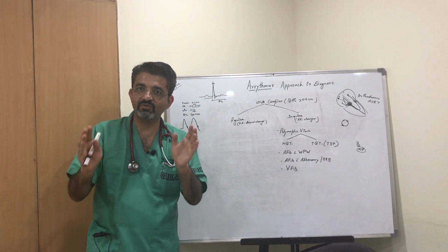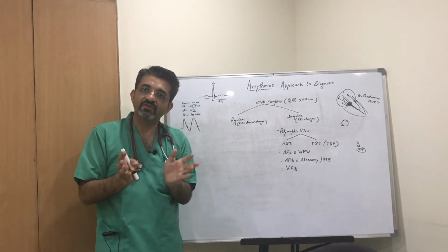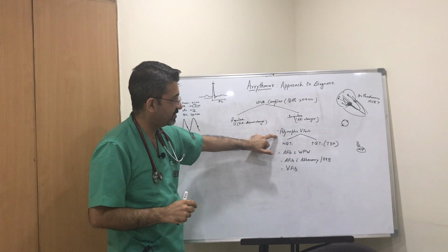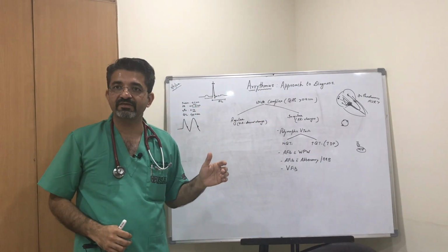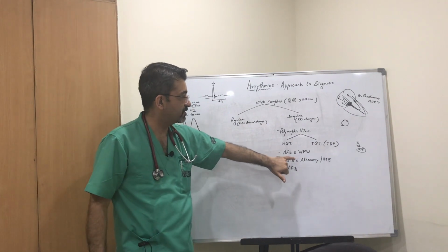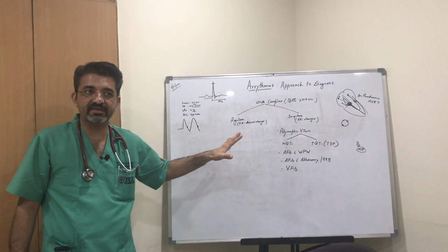So the ventricles have an ectopic focus which is giving rise to some impulse, which travels in a different direction, giving rise to wide complex tachycardia. So this is VTach. In AFib, atrial rates are higher than ventricular rates. So when you have a high rate in the ECG, it favors atrial fibrillation with WPW. It is difficult, but can be managed in exams.